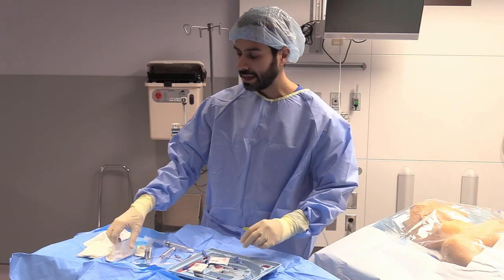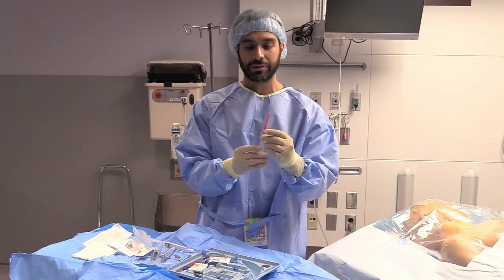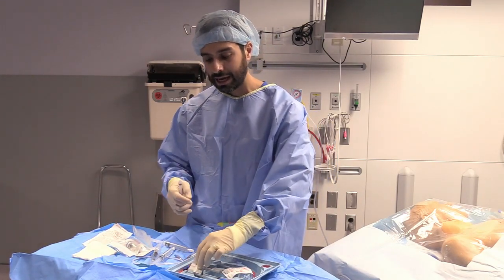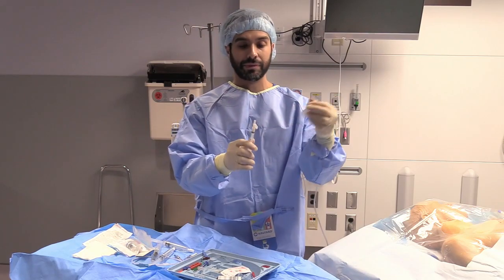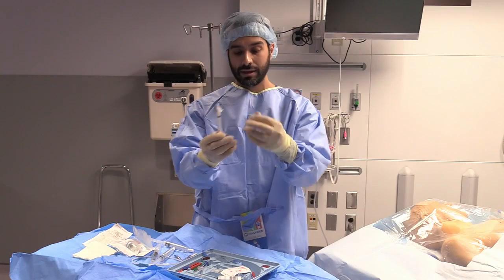I'll then use the lidocaine that comes with the kit and draw up some lidocaine with my 18 gauge blunt needle and my 3cc syringe. Take off my blunt needle, and depending on the patient's size, either use the small needle, or if I'm going to need to go more distally, I'll use the longer needle. So this is very obviously small, mostly just for a skin nick and a very superficial vein.